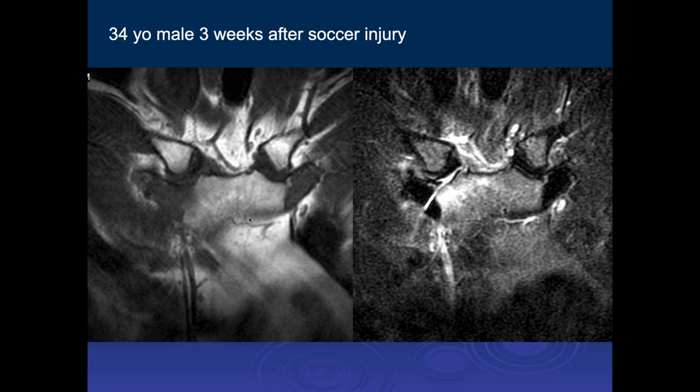We have a 34-year-old male three weeks after a soccer injury, and we have two coronal images through the sternoclavicular joints. There's fluid signal intensity and soft tissue edema within the right sternoclavicular joint extending beneath the clavicle, and some edema within the adjacent sternum. This is compatible with injury of the sternoclavicular joint. This one is also extending into the first rib, and you can see the fractures primarily going through the cartilaginous articulation of the sternum and first rib.